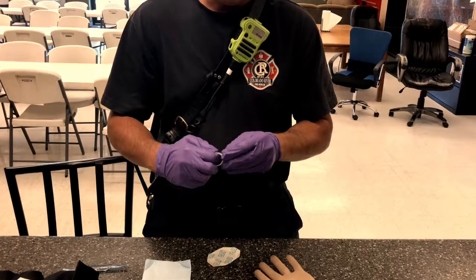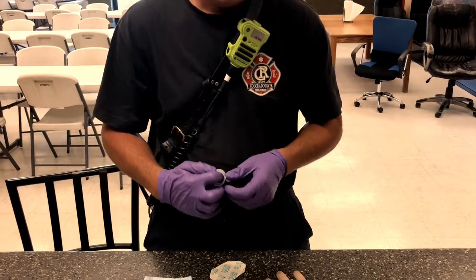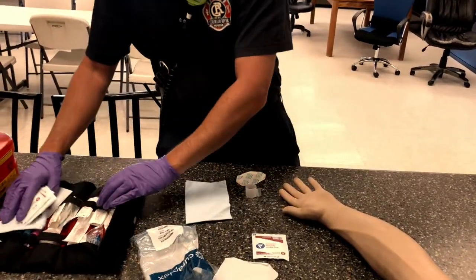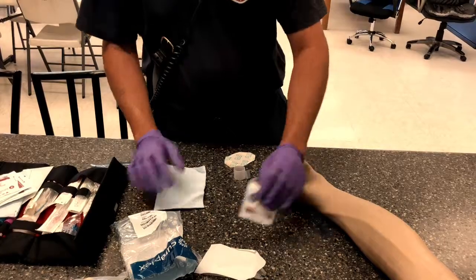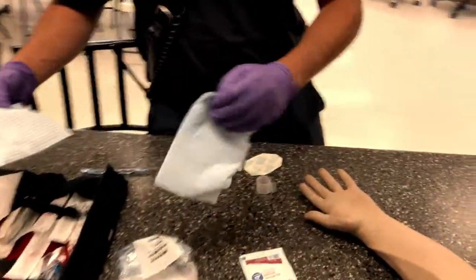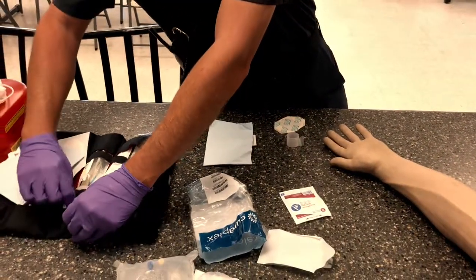Always difficult to do with gloves on. And we want to open our alcohol swab, which this kit currently didn't have one, so we'll get one of the spares out of the kit.